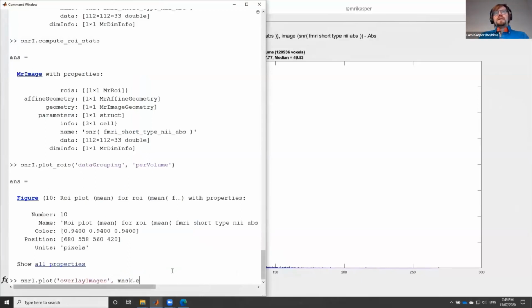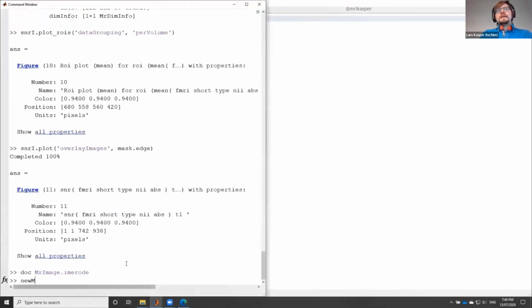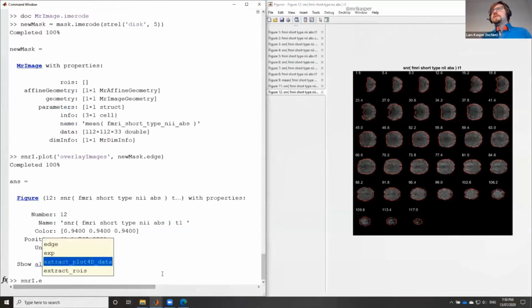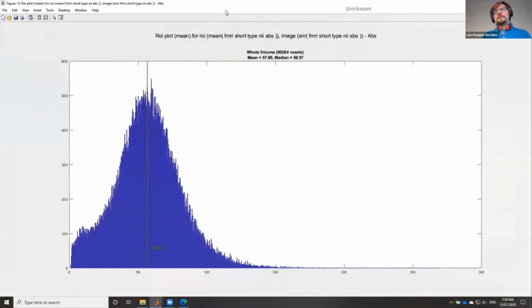And you want to know basically where actually was my mask. And you can see actually the mask is not so tight within the gray matter of the brain. So you can have a look in the documentation how to improve that mask and then create a better, more fitting mask. And you see basically this interactivity in the prototyping is really important, right? You go back from visualization to processing to visualization. And the same is true if you, for example, look for artifacts in image time series. That's one of the core things we wanted to make available with PhysIO. Yeah, sorry, with UniQ.